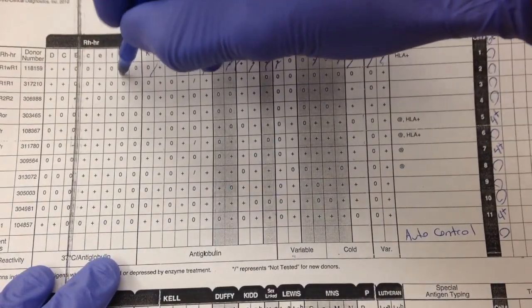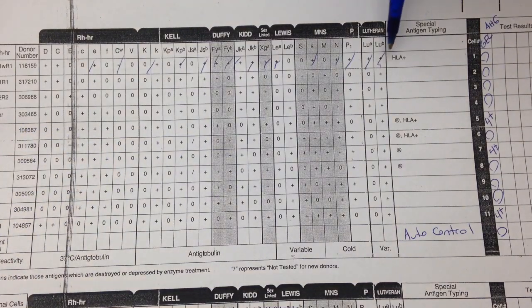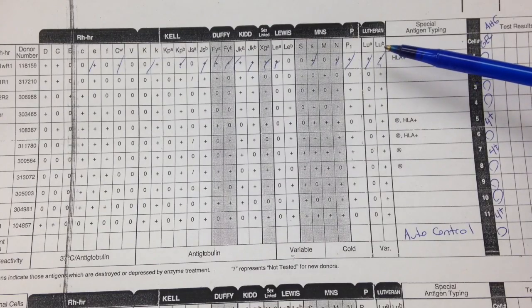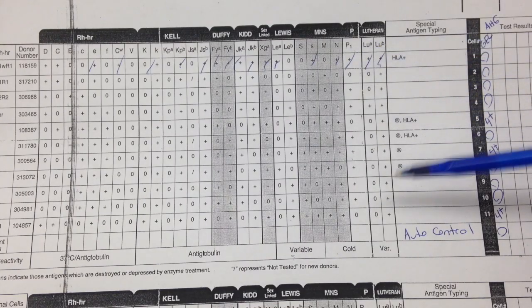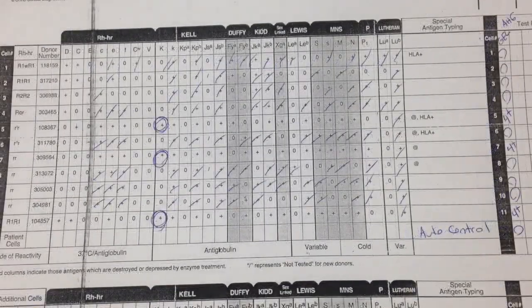So what I'm doing now is, if you have a 0 reaction, you would go through that cell and mark out all the positive antigens, because if you're getting a 0 reaction for that cell, then anything that's positive it can't be, essentially. So here I just went ahead and filled out all the little cross-outs.